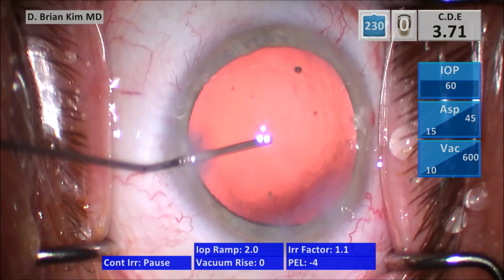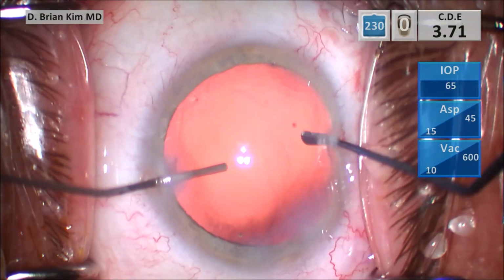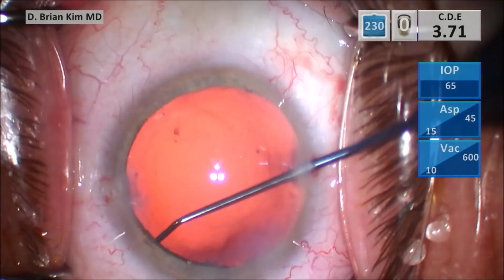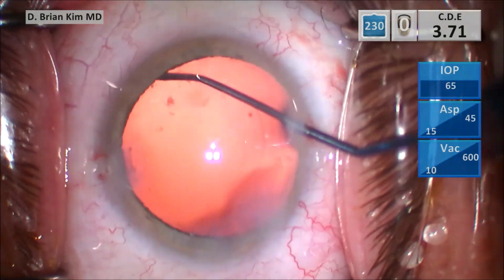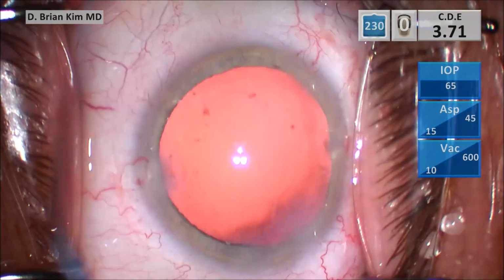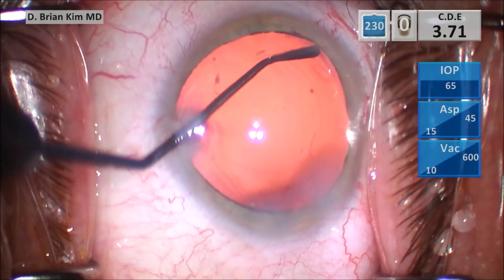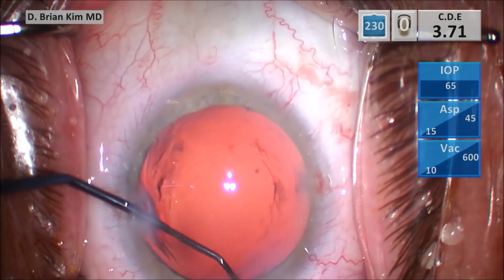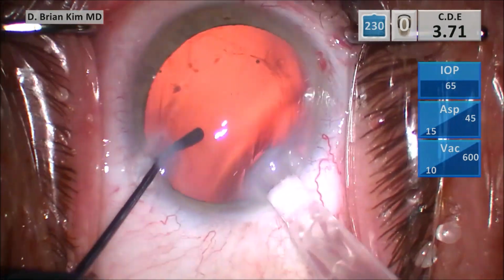And then this is cohesive viscoelastic to fill the capsular bag. And for good measure, we'll go ahead and start sweeping. Starting subincisionally, polishing and sweeping underneath the rexis edge of lens epithelial cells. And then sometimes you're able to hook cortical material in the subincisional area as well, if there is any. That's why sweeping is really advantageous. You can polish for lens epithelial cells, but also get any stubborn subincisional cortical material.